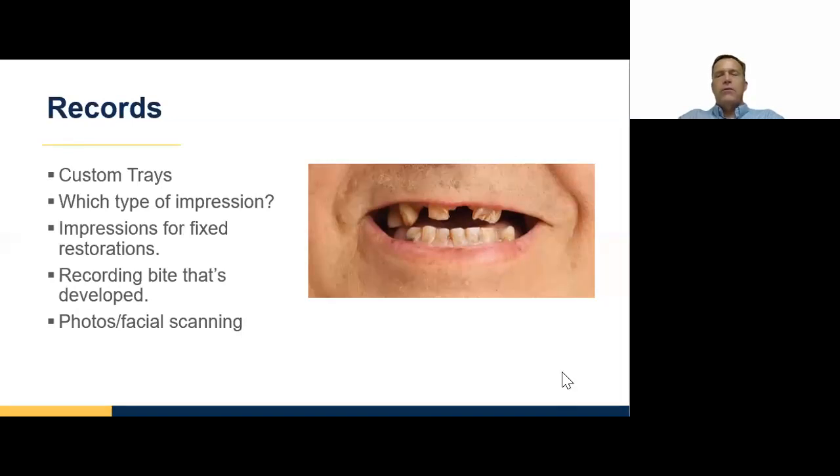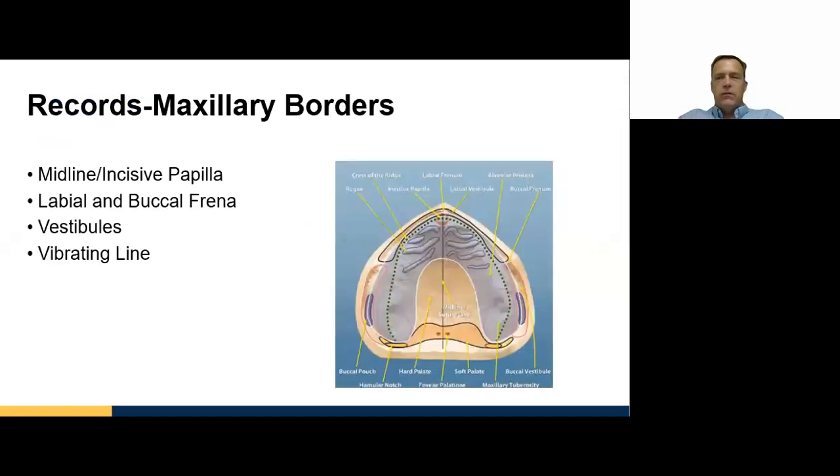Last but not least, you've done some hard work on your bite. Make sure that you record the bite registration that you've developed so that we can use that for all our final restorations.